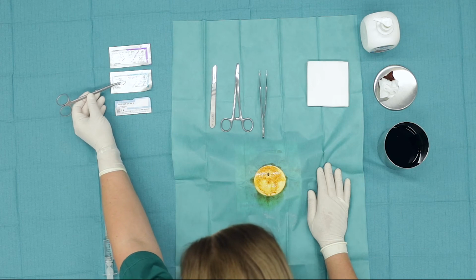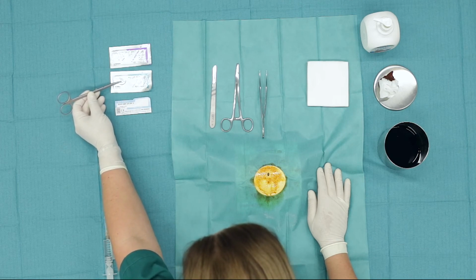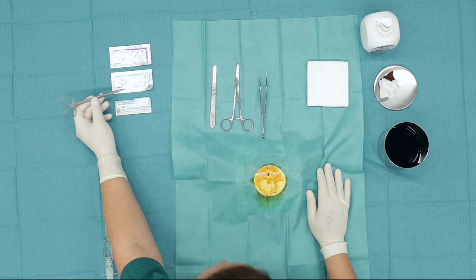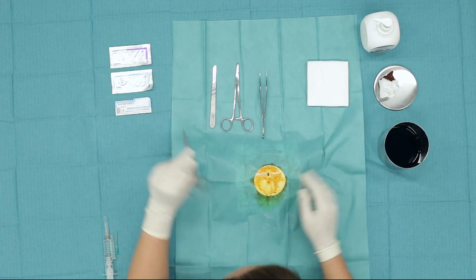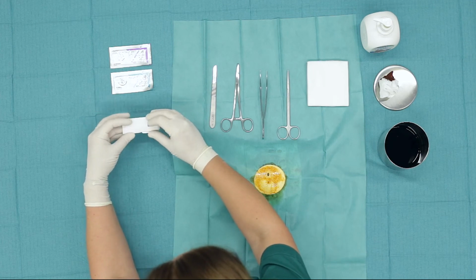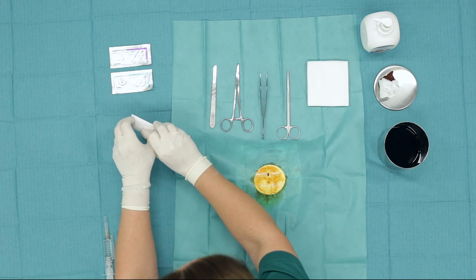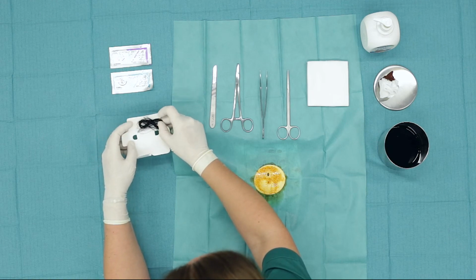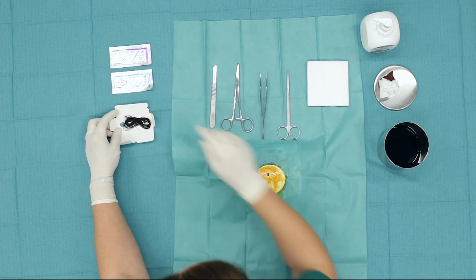While these sutures, despite having a round or non-traumatic needle as shown here, are non-absorbable sutures and their material is silk. Other stitches that I can generally use are simple ligatures, as in this one here. They do not have a needle, but are just threads that we use as ligatures.